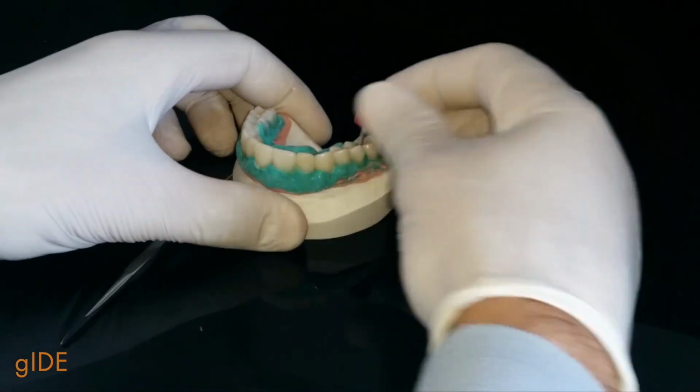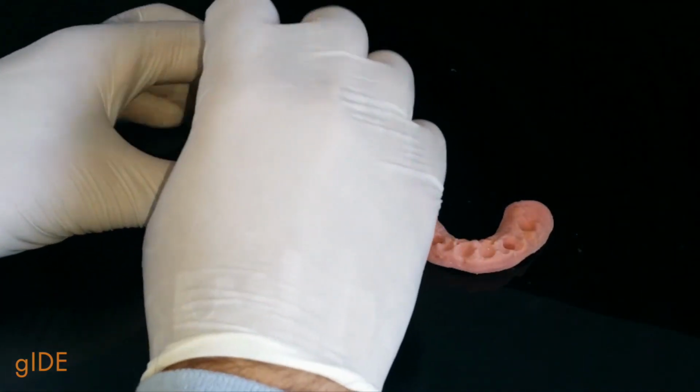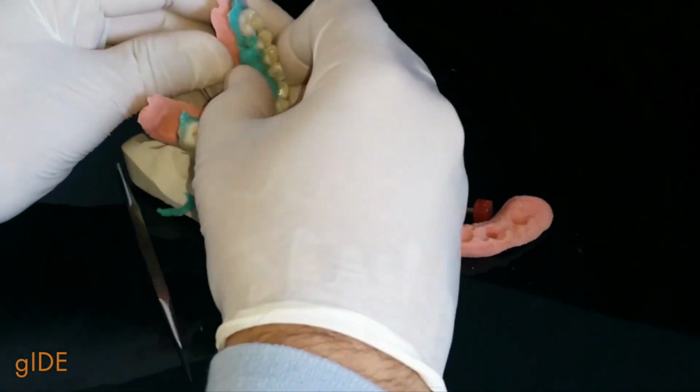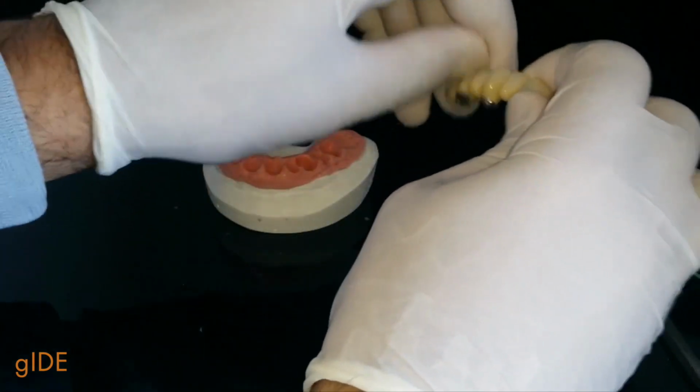So we have seen the treatment of the single tooth, the partial rehabilitation and the full arches with different approaches, but the concept is the same. I want exactly the soft tissues that I have created in the mouth with my temporary, and I have tested per month in the mouth thanks to my temporary restoration. Now, once the setting is concluded, we remove our temporary from the model. It's crucial to have placed the Vaseline, the isolator, between the silicone, otherwise it's difficult to remove the silicone material from the soft tissue reconstruction.